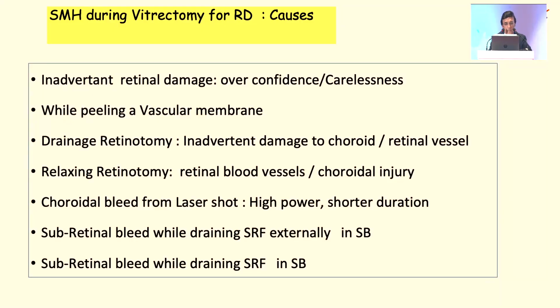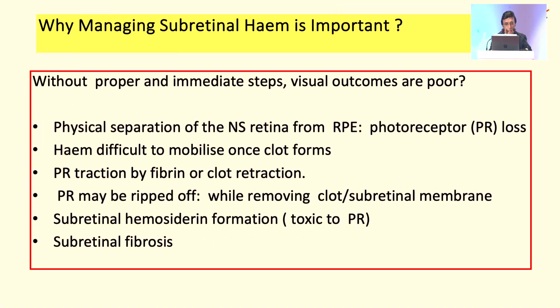A subretinal bleed can also happen when you do external drainage of a scleral buckle, and then you may have to convert, and a subretinal bleed can occur while draining the SRF. So why is managing subretinal heme important?